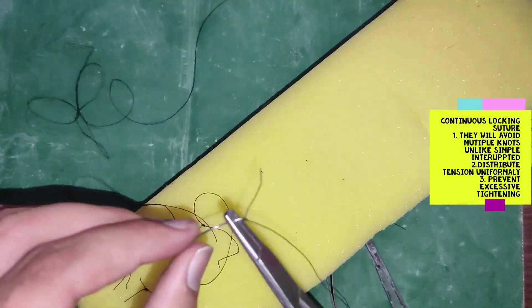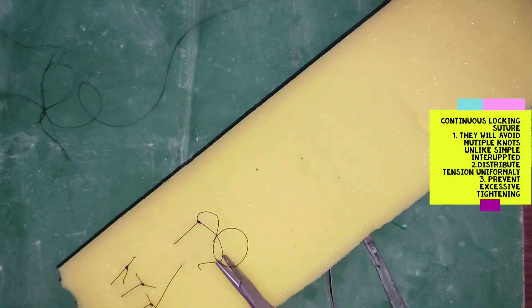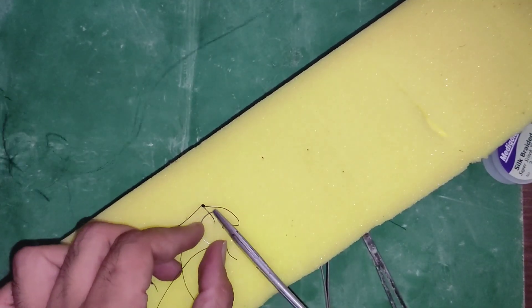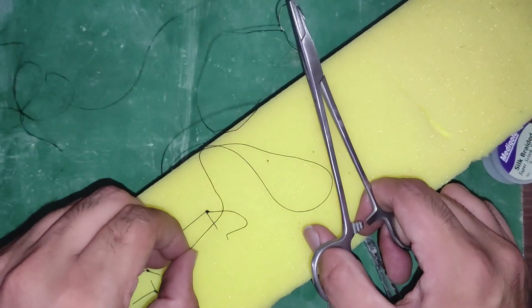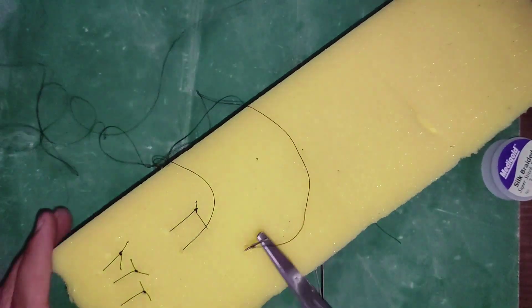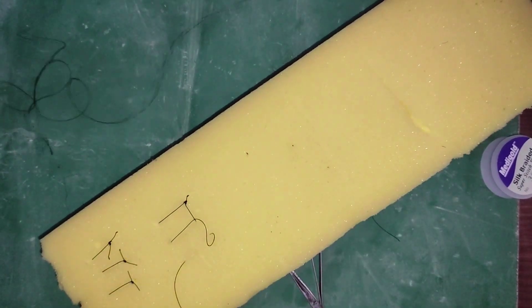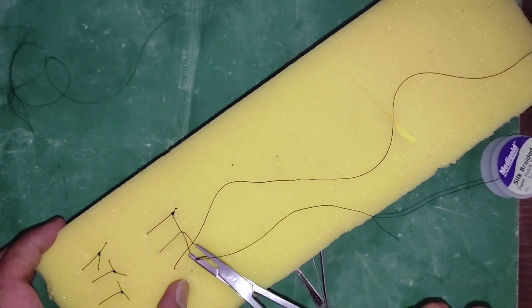As you have seen, I have cut the suture. Now, where I started suturing, I will continue the same suturing. Focus on this point: I am going to pass the needle through the previous loop of suture — this is the locking step. Continue this process along the incision.